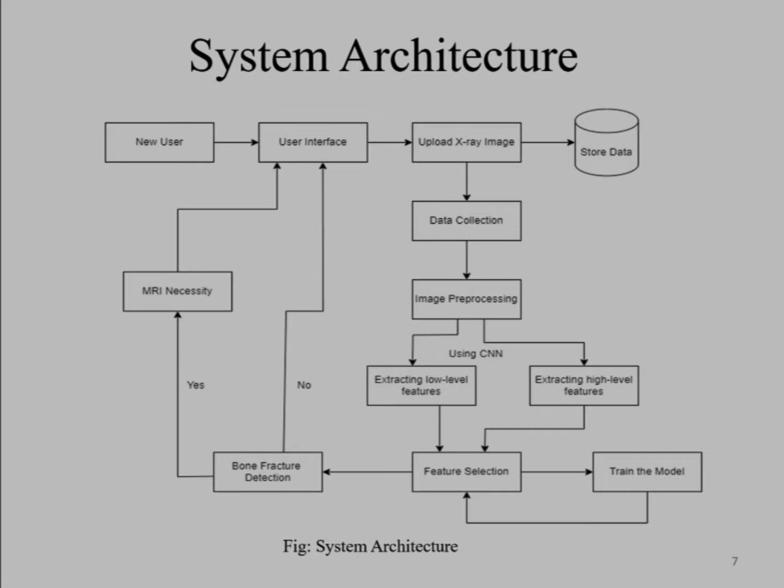Bone fracture detection. After training the model, the system is able to analyze new X-ray images and detect the presence of fractures with high reliability.